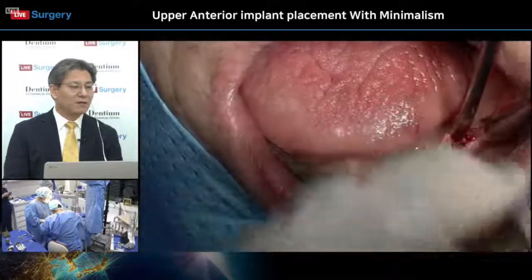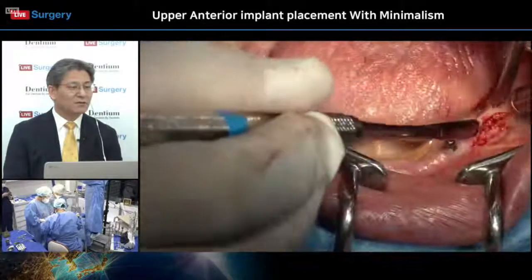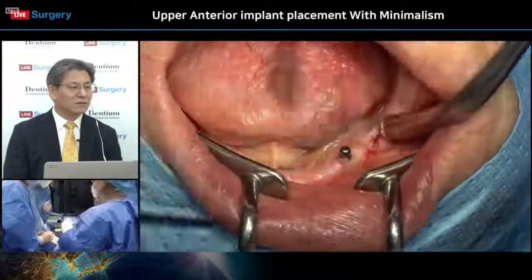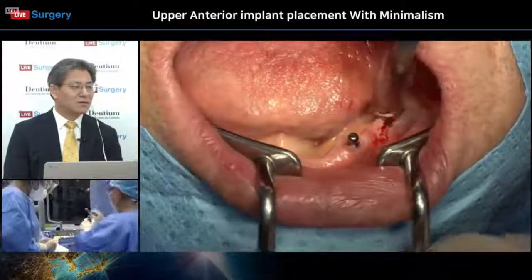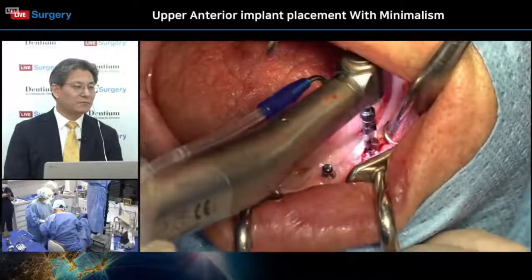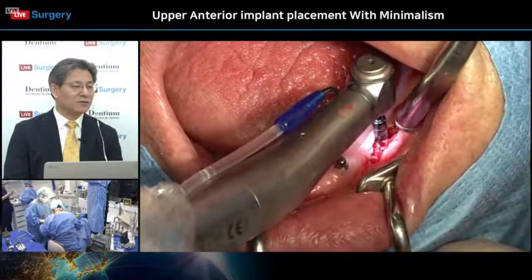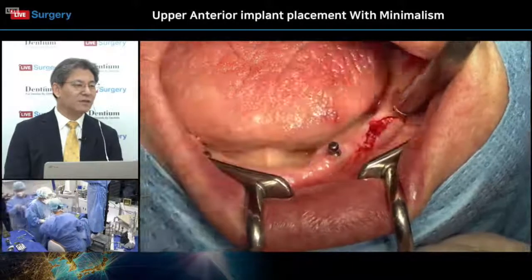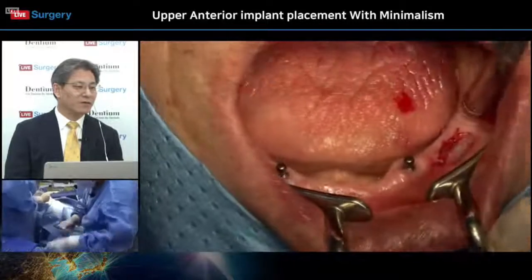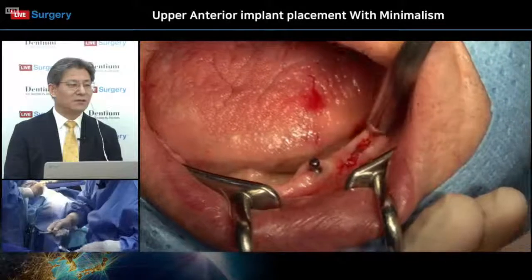So, which is better? 4.0? We have drilled up to 3.5. But anyway, we'll try to place the 4.0. Yeah. Is 4.0 good? Yeah, he's going to 4.0. Yes. Yeah, 4.0 drill. Okay, fine. Until 11 millimeter. So, yeah, very nice. The 4.0 will be fine.